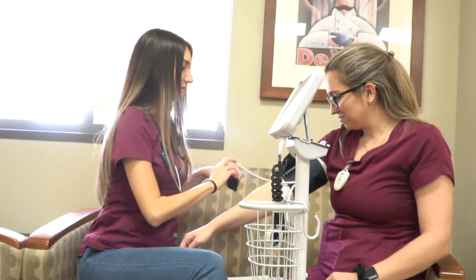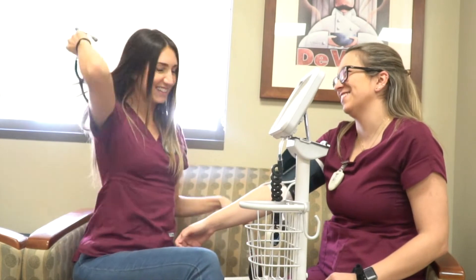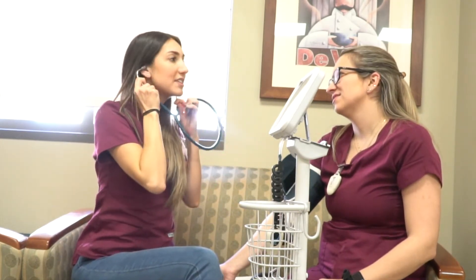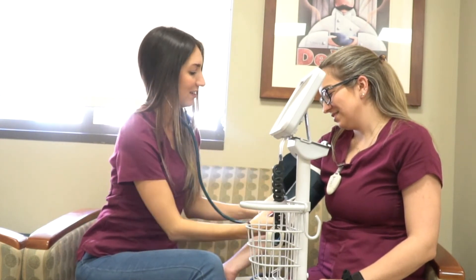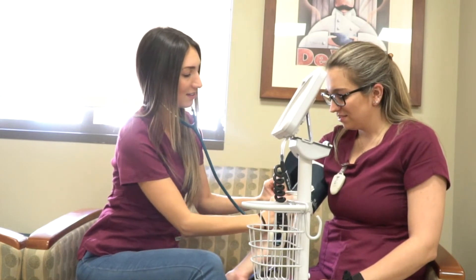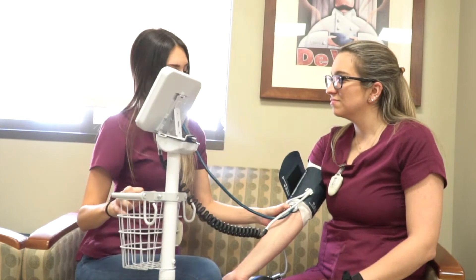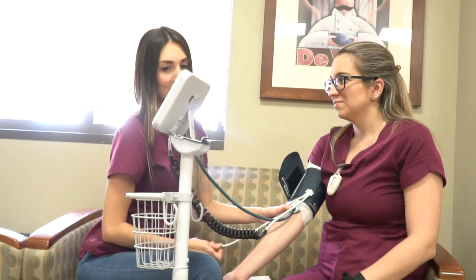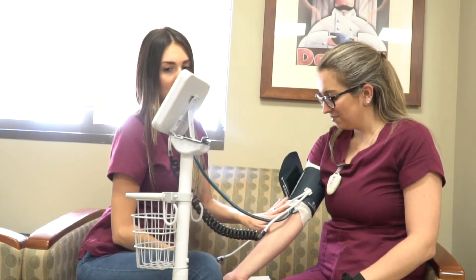After you make sure that it's in the appropriate position and it's not upside down, the bulb and the tubes should be facing down towards their wrist. Lightly press the stethoscope's bell over the brachial artery, which is going to be right below the cuff's edge if you placed it properly. Rapidly inflate the cuff to about 180 millimeters of mercury or higher and then start to release the air from the air valve really slowly at about three millimeters per second.